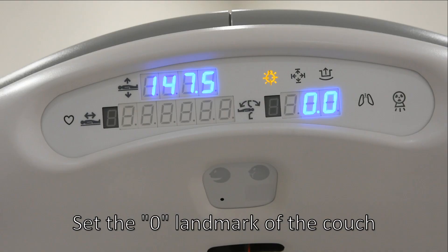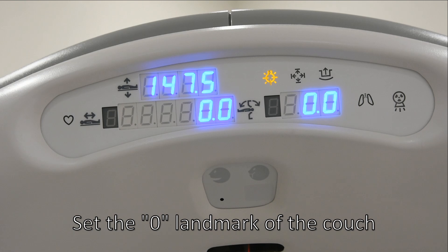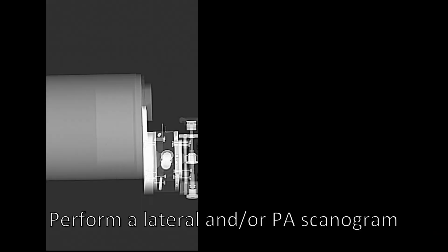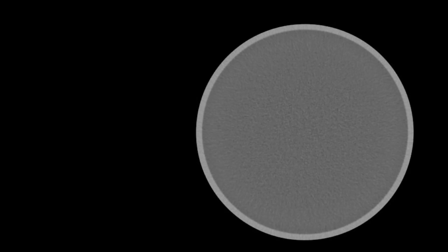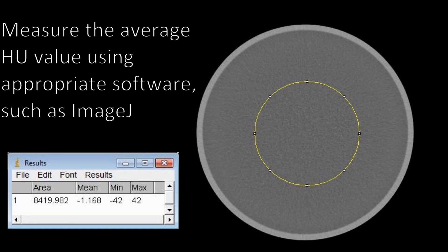Set the zero landmark of the couch. Perform a lateral and or posterior anterior scanogram. Measure the average Hounsfield unit value using appropriate software such as ImageJ.